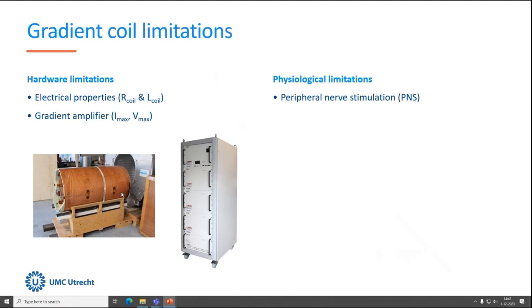The larger the coil, the larger the resistance, and the slower it acts. The slowness of the coil is called inductance, or self-inductance. It's the property of a conductor to resist any change in the current. It's Lenz's law. It's just physics, but this is how it is. The lower this value, the more responsive a coil becomes. And how do you do that? One way is to reduce the number of windings or to make it smaller.